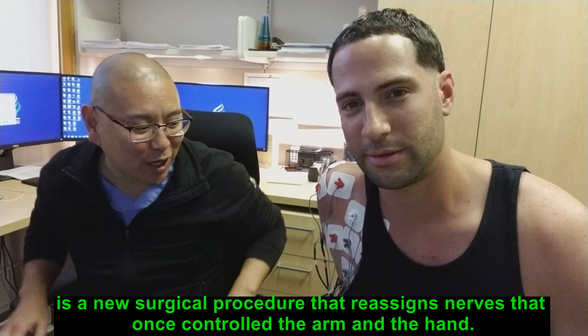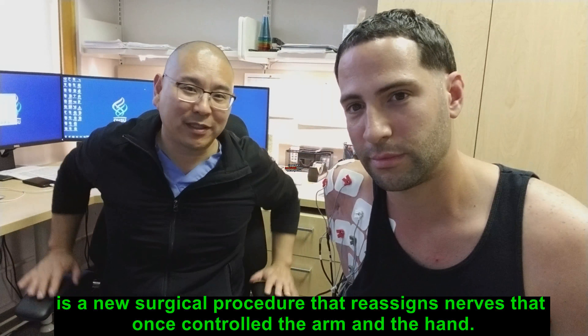As you know, this is Dr. Chi, Victor Peroso — he's the one that did my surgery, targeted muscle re-innervation. Can you explain a little bit what it is and what you did and what these electrodes are?